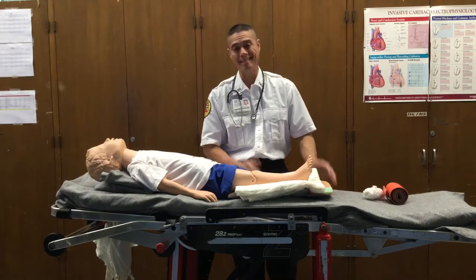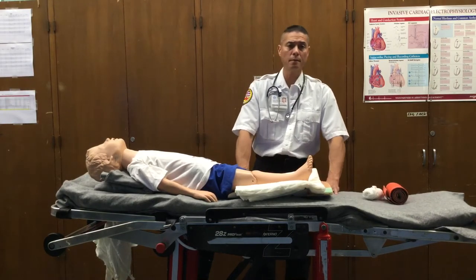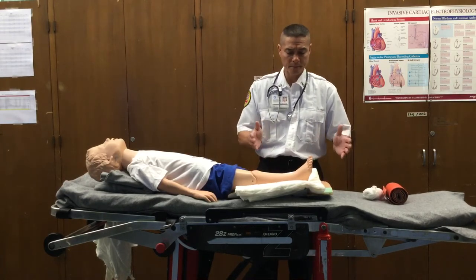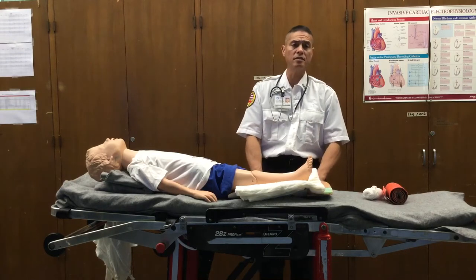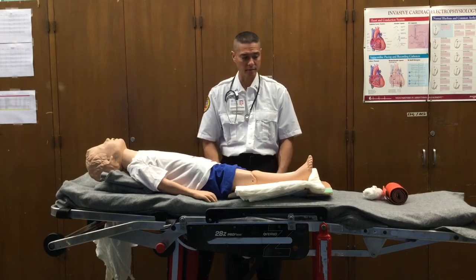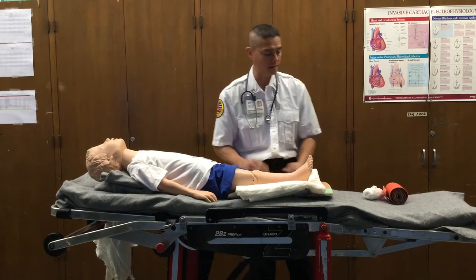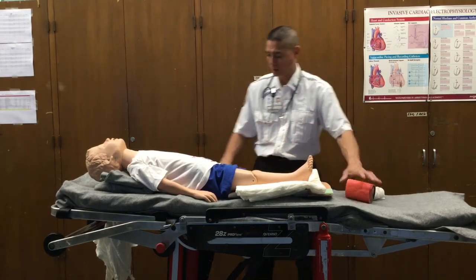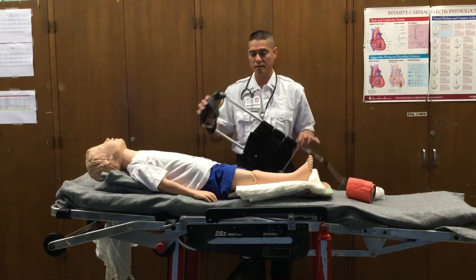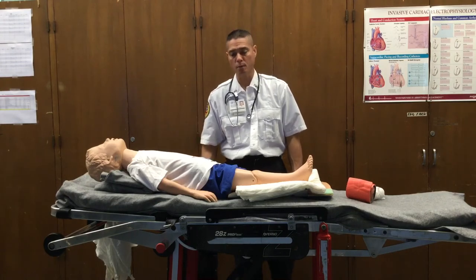We're going to continue to monitor distal parameters — pulse, motor, sensory, circulation, color, and temperature — throughout transport of our patient. Again, there are many different types of splinting devices: cardboard splints, improvised splints, buddy splints, this type of soft malleable commercialized splint. For other long bone injuries, more age-specifically for the adult, we also have a pediatric-size traction splint for long bone immobilization.